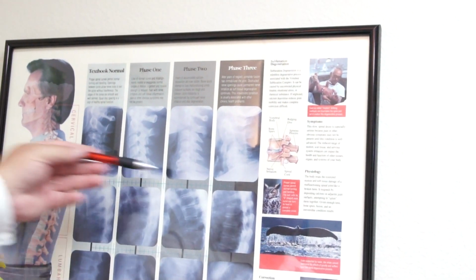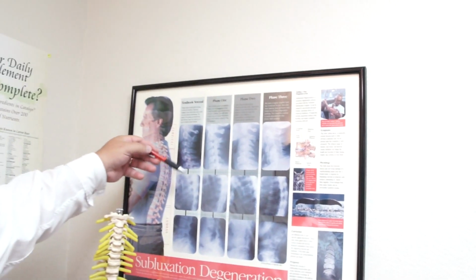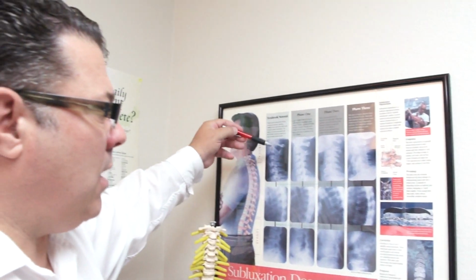So I get patients that come in at all 3 different levels, and our goal is to try and get them back to textbook normal, and this is done through x-ray.